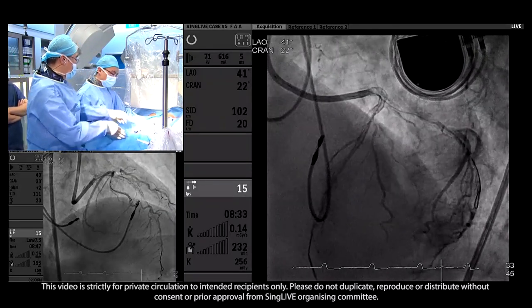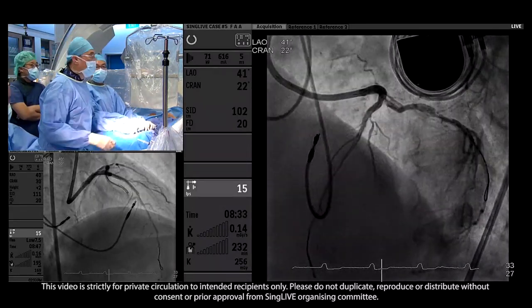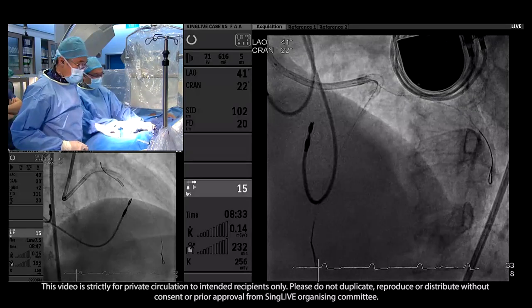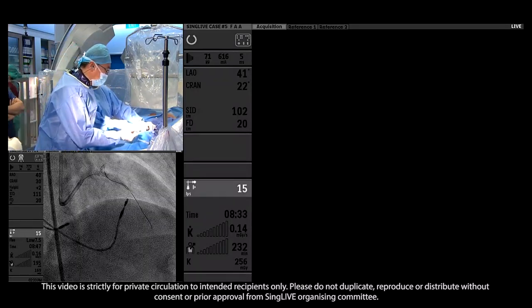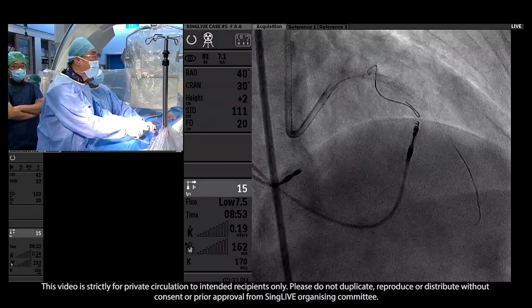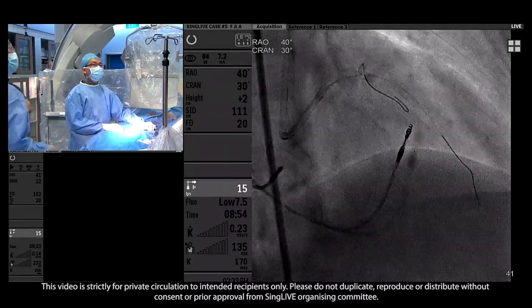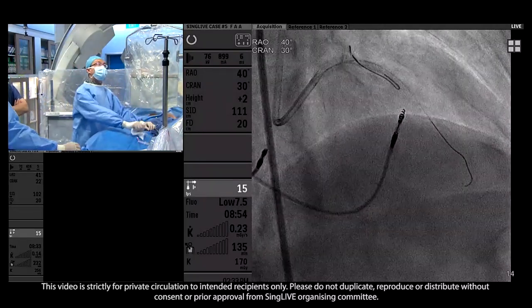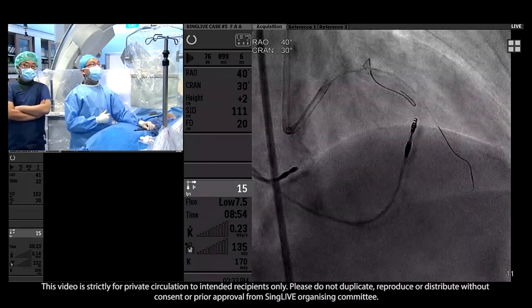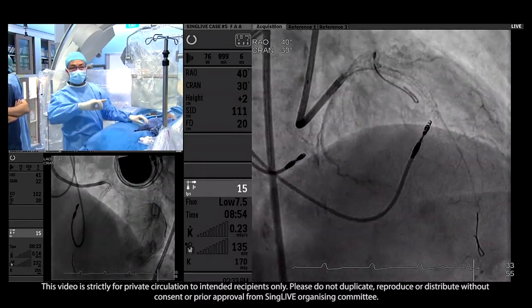We're going to use a high-pressure balloon to optimize the stents. So we use a 4.0 short NC balloon. The main vessel size is about 4.4, so 4.0 with a very high-pressure balloon will be safe. But in the LAD, the vessel size is about 3.5, so do not dilate the LAD too much. We can definitely use IVUS-guided measurement to decide the NC balloon size on the basis of IVUS. Maybe do the caudal injection also, caudal view.